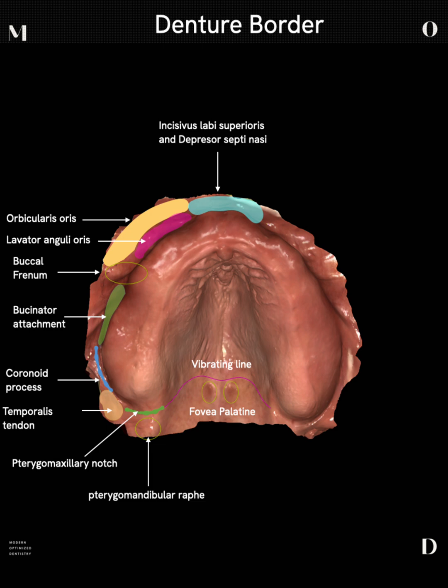Then we have our temporalis tendon. The temporalis tendon does not actually attach to the maxilla — it attaches to the coronoid process of the mandible — but depending on the patient, those bundles can be quite pronounced in this corner. Combined with the buccal fat pad, this is oftentimes a difficult area to scan, which is where retractors come into play for this temporalis tendon area.